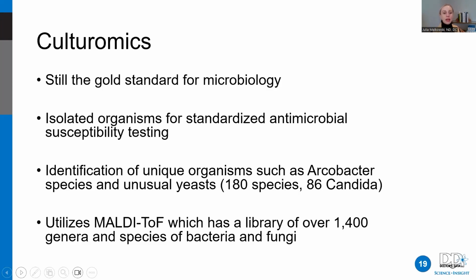And again, this is a unique application. This is akin to fishing with a wide net. So you're going in the ocean, you're taking out a large net and you're putting it into the ocean and you're grabbing whatever you can in that environment, in that microenvironment. And that's what culturomics is, because we are culturing in multiple different plates and media for the growth of bacteria and yeast. And then what is grown is reported on the report.